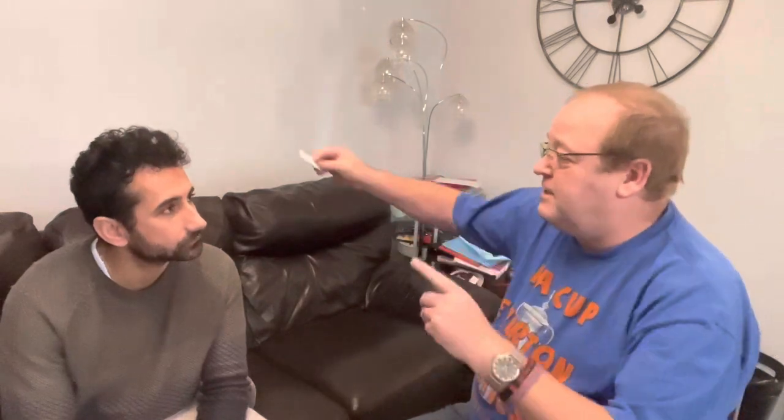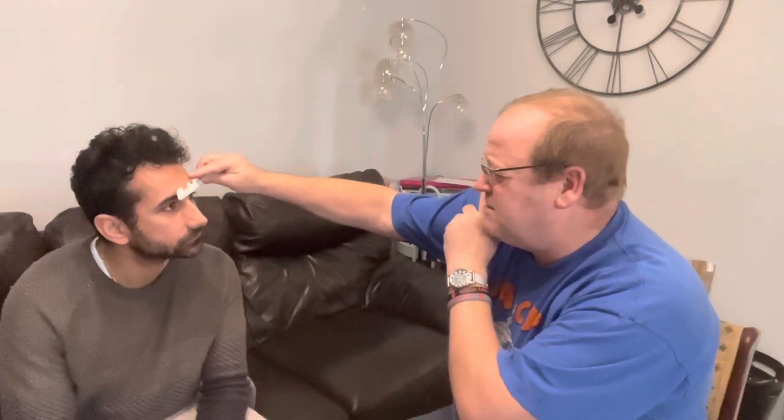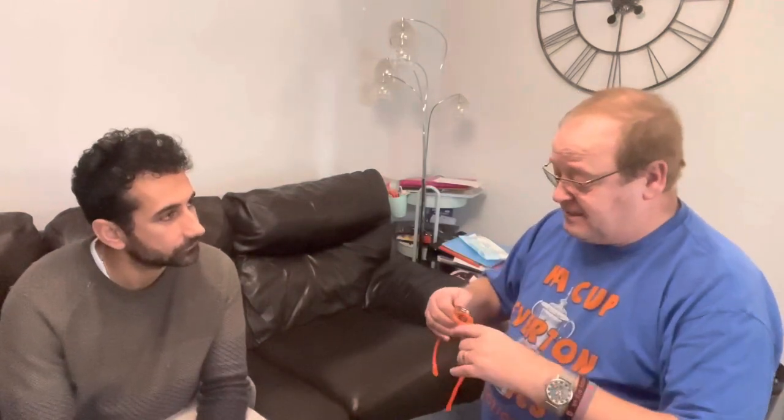So what I'm going to do, I'm going to check against your prescription and just see if we can improve on that a little bit. So I'm going to measure your pupil distance to start with. If you look at my finger — and then across. That's 66. So I've got a nice set of trial frames here that measure all the way up to a 70pd frame. So I've measured you for your distance PD, that's 66.